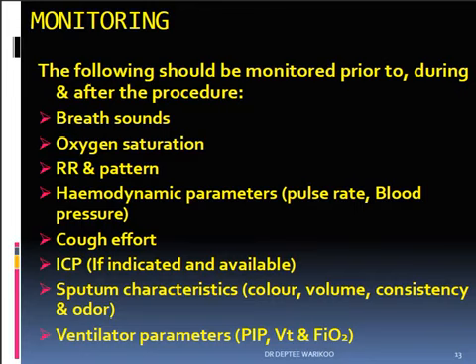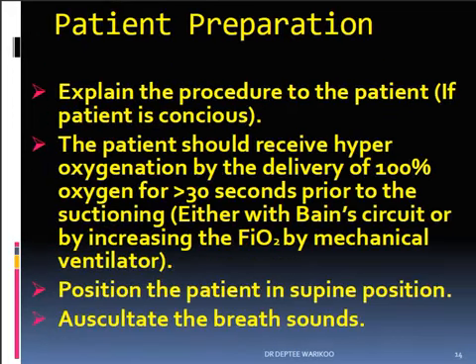You have to evaluate and monitor sputum, the color, the volume, consistency and the odor. This I have already told you. Then other ventilator parameters like PIP, FiO2, these things have to be monitored properly.